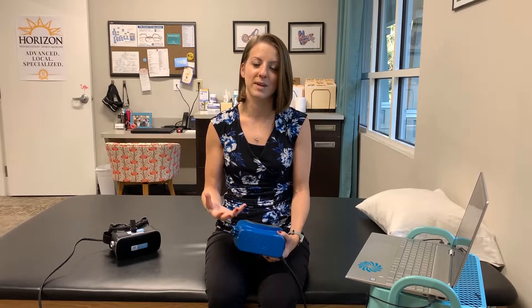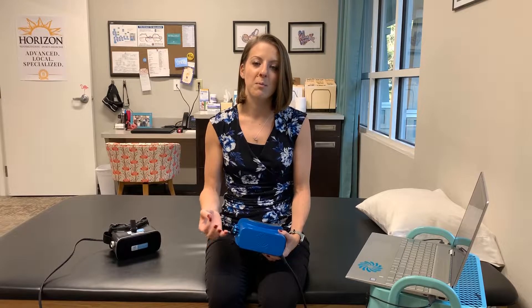Vestibular First is a company that was started by a practicing physical therapist who also specializes in vestibular rehabilitation and her husband, who helped design a pair of goggles to meet the needs of her clinic — a pair of infrared goggles where she could look at patients' eyes up close in the dark, but be able to afford to ask her clinic to pay for them. What they've created is a really great system that's easy to use, simple, and affordable to get other clinicians into vestibular rehabilitation.